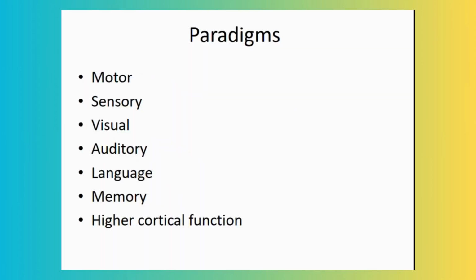So what are the paradigms? Paradigms are basically commands or tasks based on what we want to get from the patient. It can be motor, sensory, visual, auditory, language, memory, anything which we want from the brain to see the particular information.